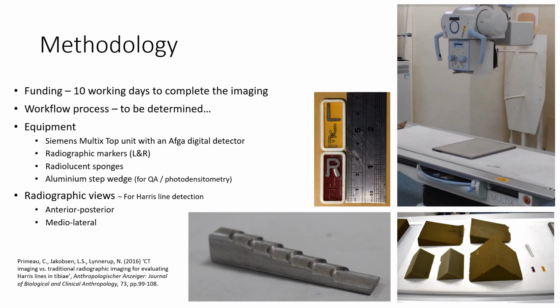The methodology, how did we do it? I had funding for 10 working days to complete the imaging. The workflow process was to be determined. That was part of the whole reason we're doing the imaging, was to learn about how we would fit in together as a team. The equipment, though, we did know. We had a Siemens Multix Top unit with an AGFA digital detector, meaning we can X-ray bones rapidly without needing to process the images. It came on the screen within a couple of seconds.